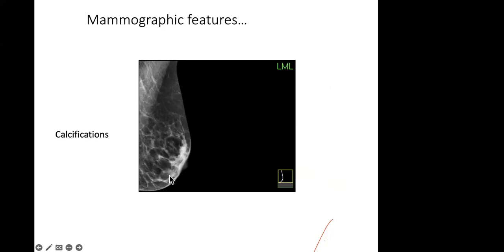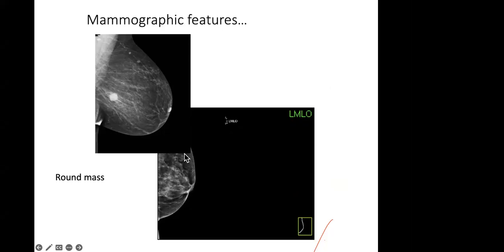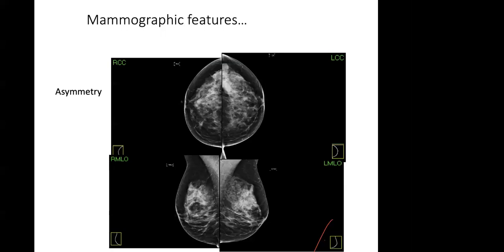Here we have a very dense mammogram with what look like intramammary lymph nodes — also dense. A large vessel coming down is almost saying 'feed me' because of what may be a typical cancer nearby. There's also a soft tissue mass. For asymmetry in a dense breast, you can see one area looks slightly different — it's good to check like for like, looking across the breast and noticing what doesn't look the same.